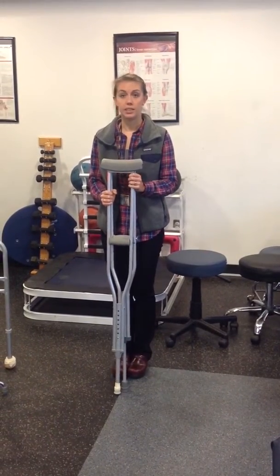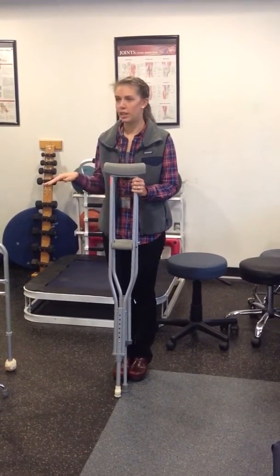This video is going to discuss how to properly fit assistive devices, including crutches, cane, and walker.